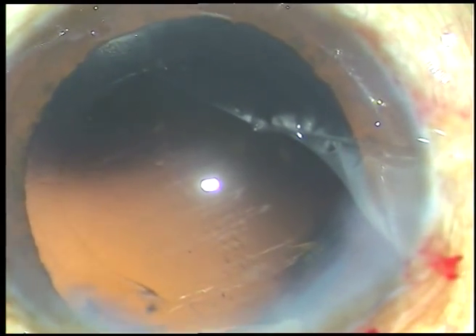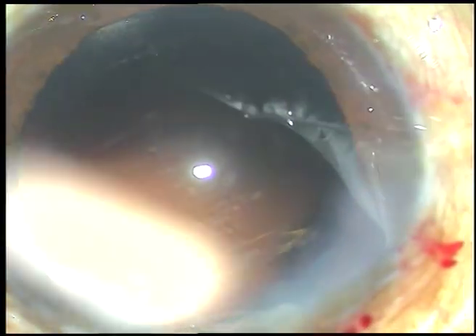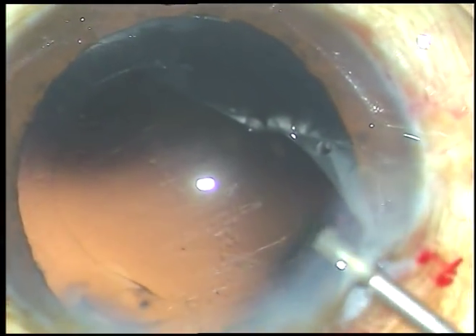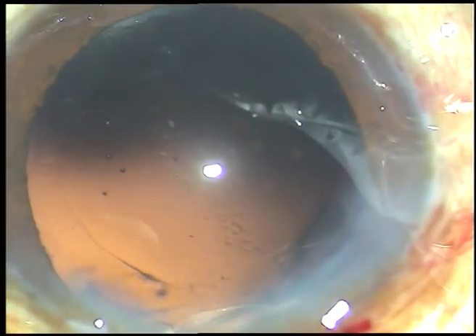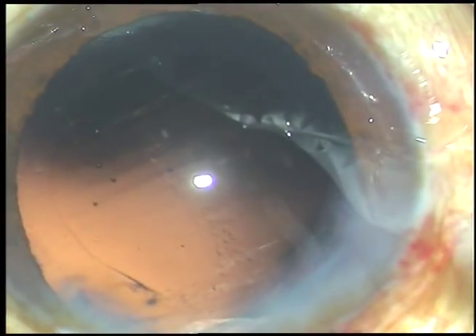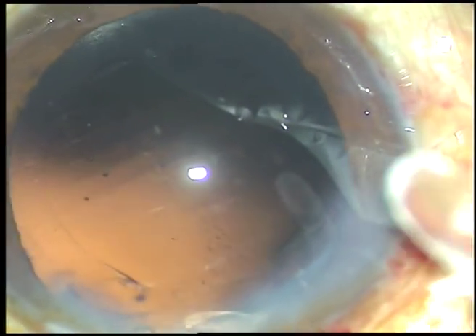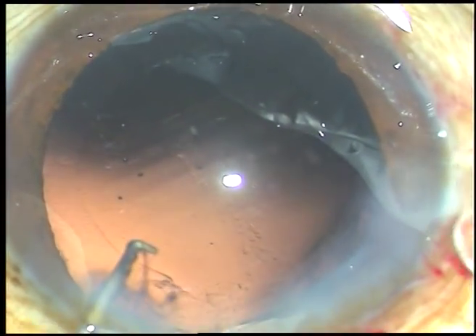Dear colleagues, this patient had cataract with traumatic zonular dialysis from 11 o'clock to 2 o'clock. In the previous video, I have shown up to cortical cleanup. And now, in this part of the video, I am going to show implantation of the intraocular lens and the subsequent steps.